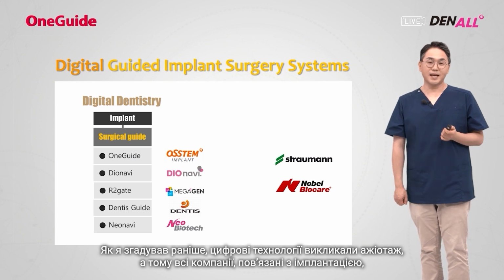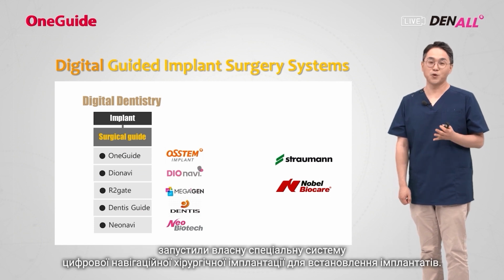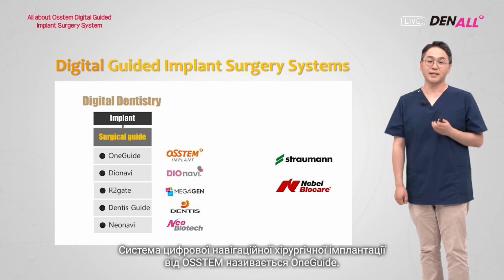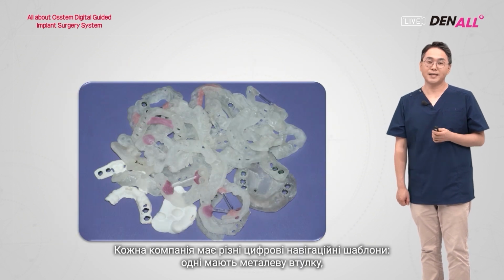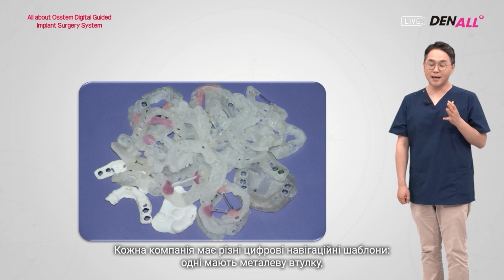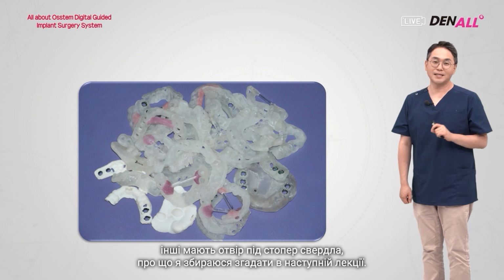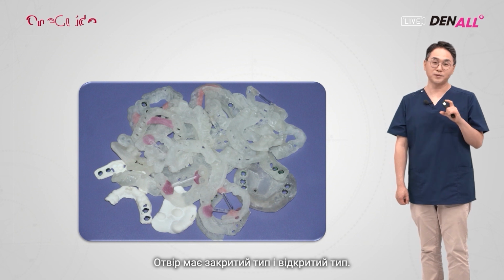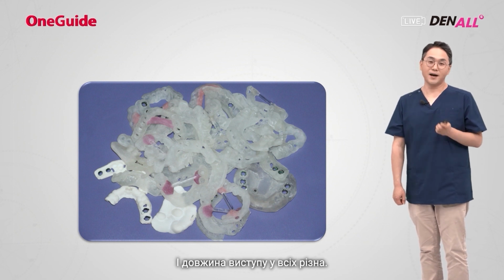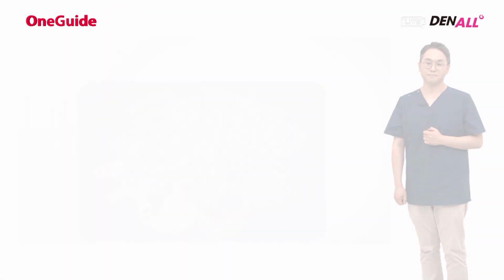As mentioned earlier, digital is all the hype. So all implant companies have launched a dedicated digital guide implant surgery system for implant placement. Osstem's digital guide surgery system is One Guide. Each company has a different digital guide template. Some have a metal sleeve, some have an offset, which I'm going to mention in the next lecture. Offset has a fixed type and a variable type, and offset length is all different. If you want to use One Guide well, you need to understand its characteristics.